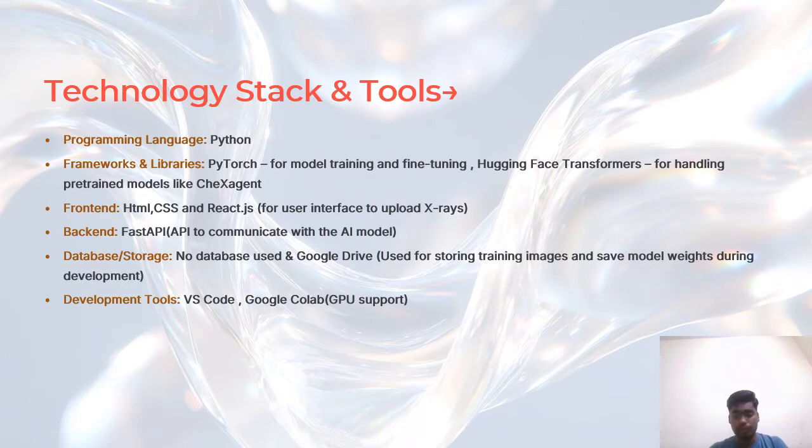Coming to storage, we use Google Drive. It is used to store X-ray images and model weights, and we didn't use any database. For development tools, we use VS Code and Google Colab. It is used for coding and GPU training support.